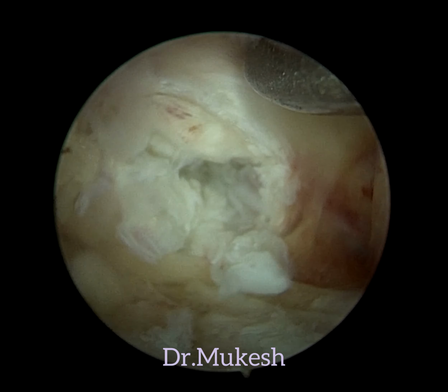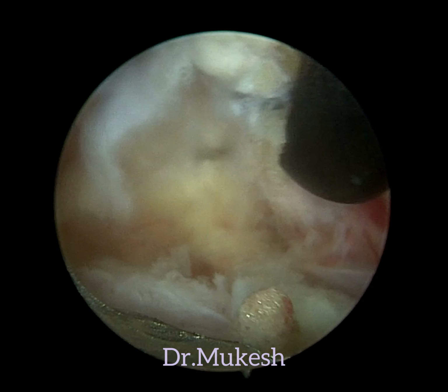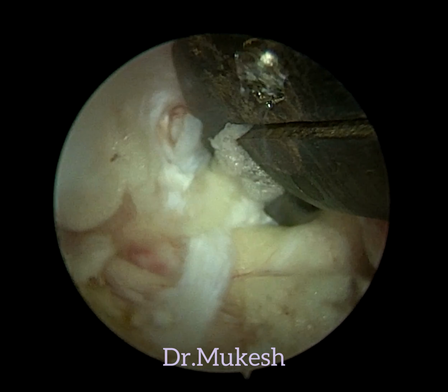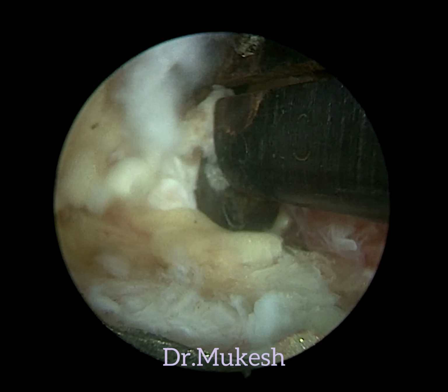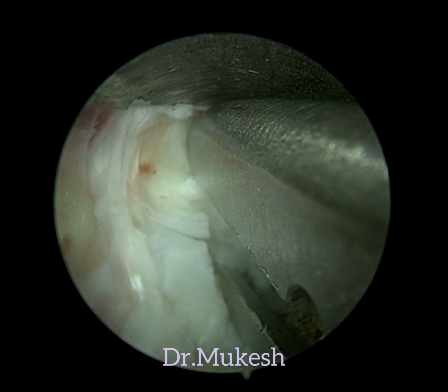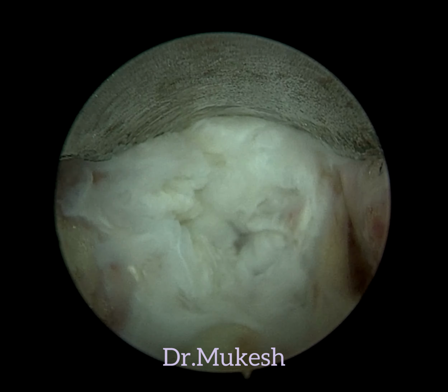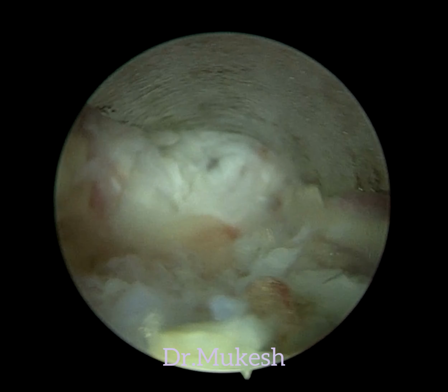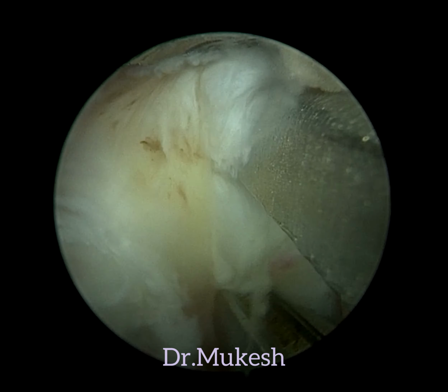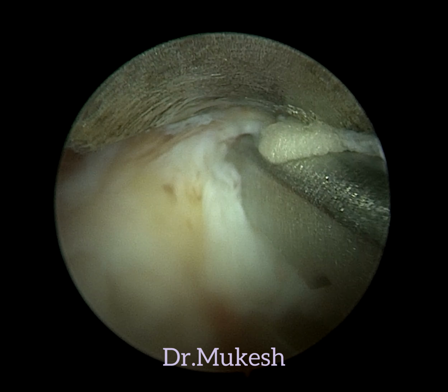Initially there was just this bulge which was visible, so we decided to take this bulge out, and we were just trying to look for another big fragment, because this was not the fragment which was apparent on MRI. So we just slightly retracted neurostructure medially. Then there was acute fragment which was visible, so that fragment was quite large in size.